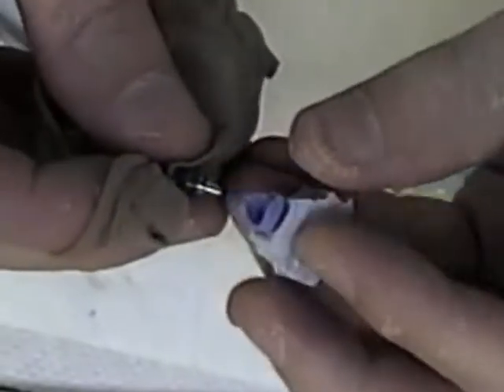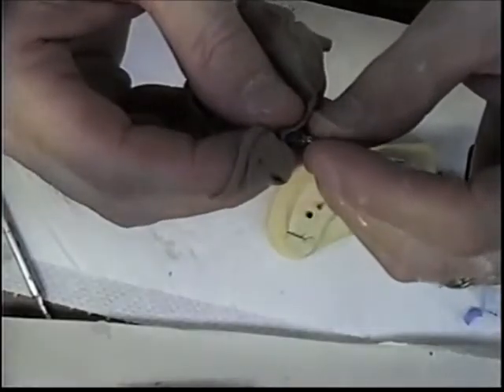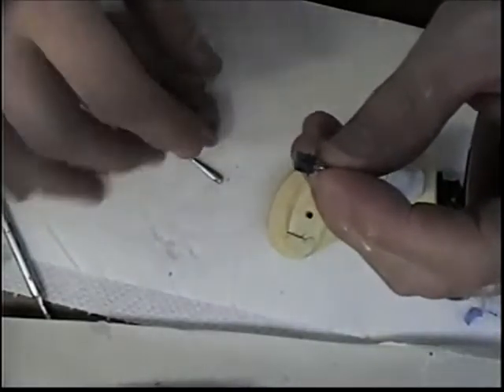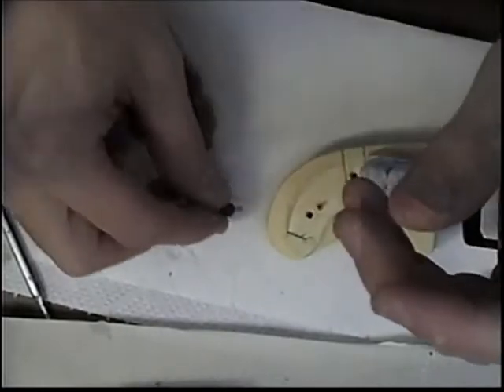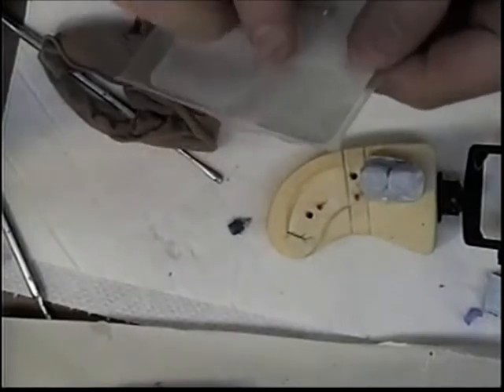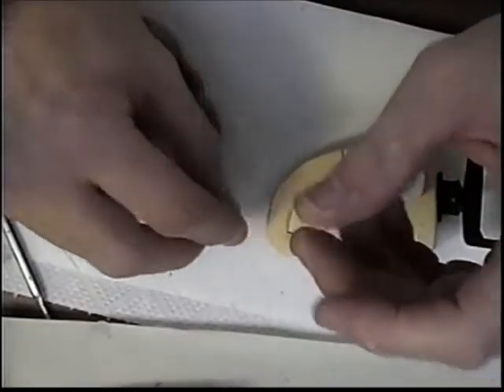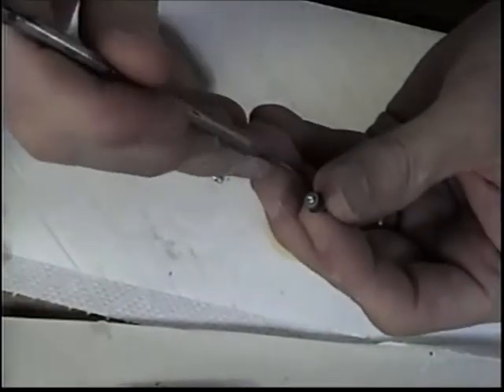Now I'm going to remove the abutment. I have a screw — the lab screw — actually this will probably be the permanent screw. I'm going to go ahead and put it in just so that I've got a little extension there to hold on to.